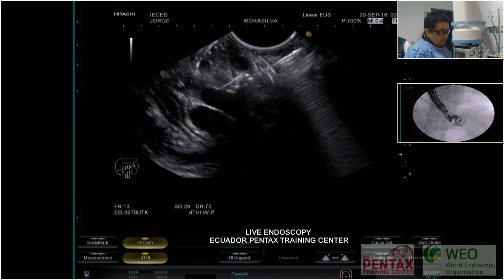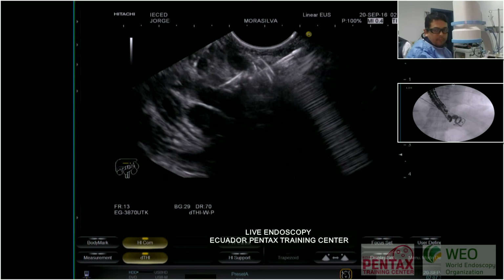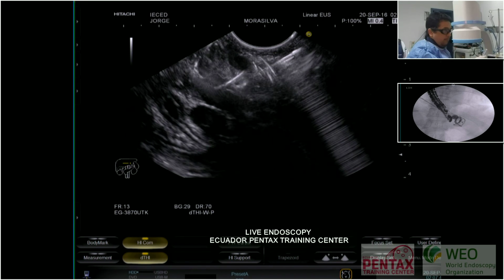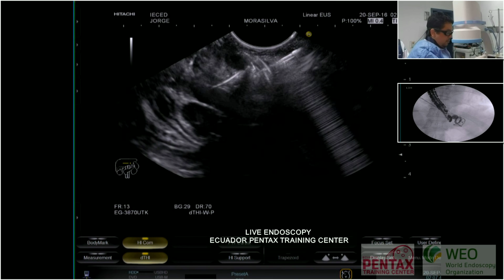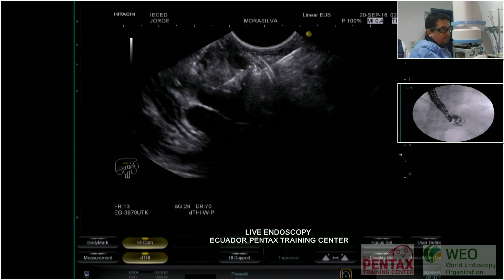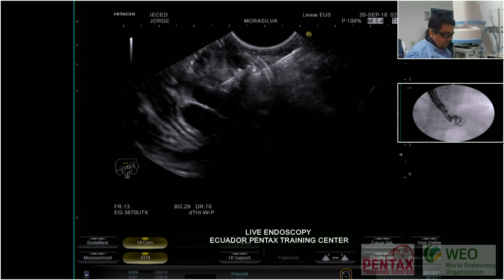Yeah. So now we will change our saline solution and I will put the cyanoacrylate injection. And I will flush again.